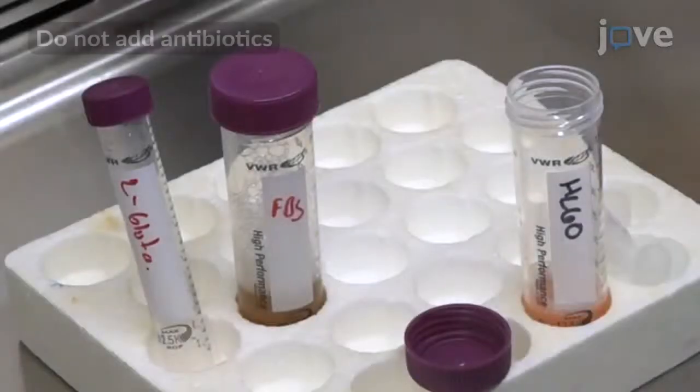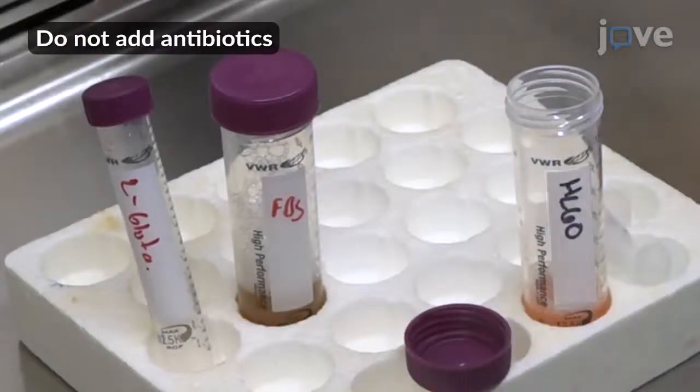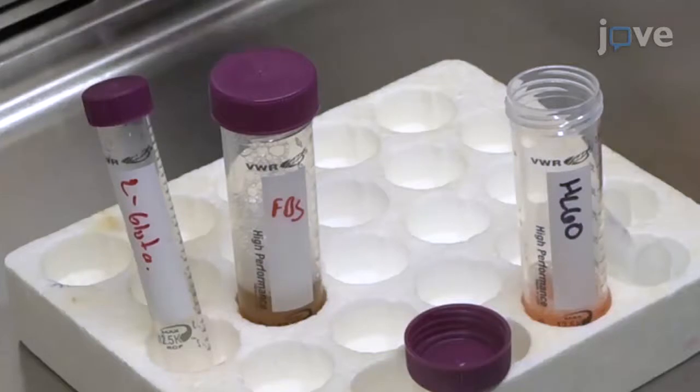To begin, prepare HL-60 cell culture media composed of 500 mL RPMI supplemented with L-glutamine and 50 mL heat-inactivated fetal bovine serum.